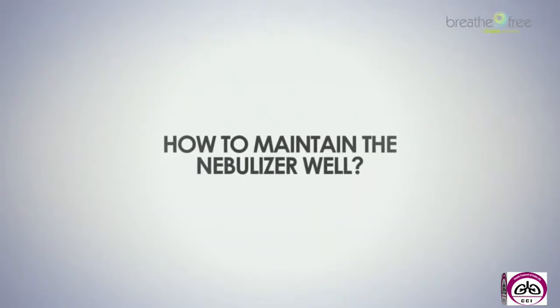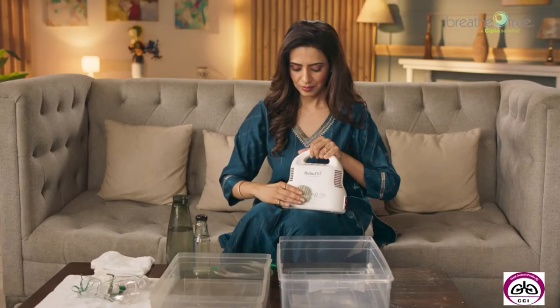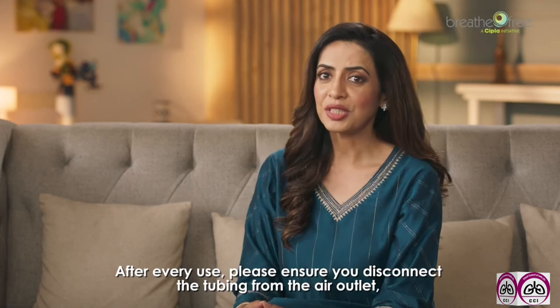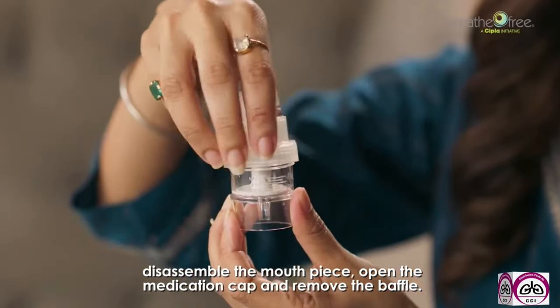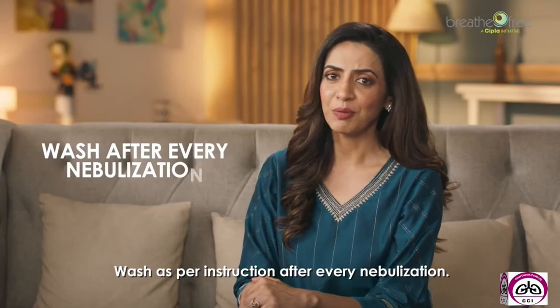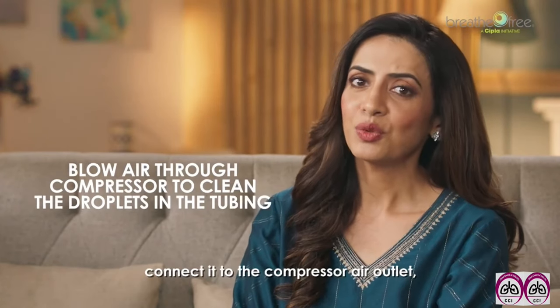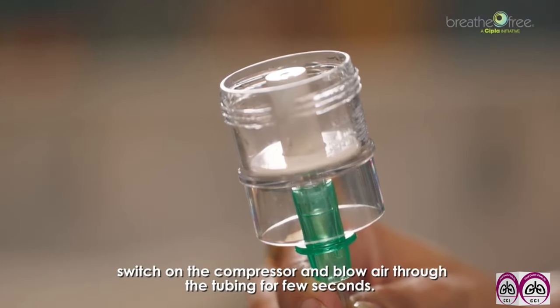Maintenance of the nebulizer. The filter should be changed when it gets discolored. Wipe the outside of the compressor with a clean cloth regularly. After every use, please ensure you disconnect the tubing from the air outlet. Disassemble the mouthpiece, open the medication cap, and remove the baffle. Wash as per instruction after every nebulization. Wipe the outlet surface of the tubing regularly. If you notice some liquid droplets in the tubing, connect it to the compressor air outlet. Switch on the compressor and blow air through the tubing for a few seconds.